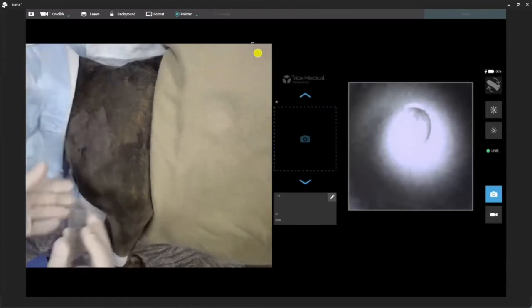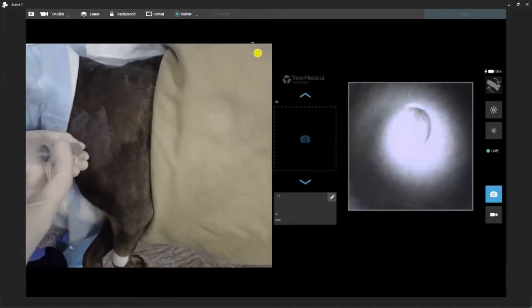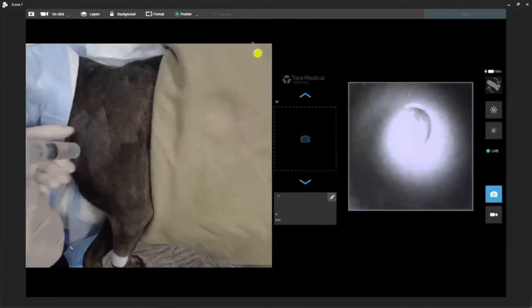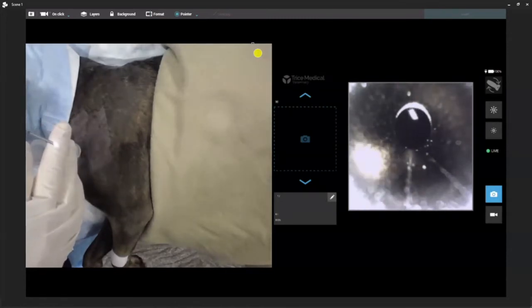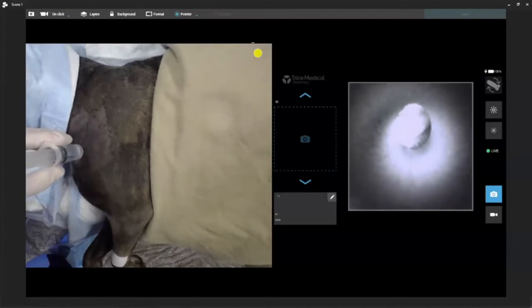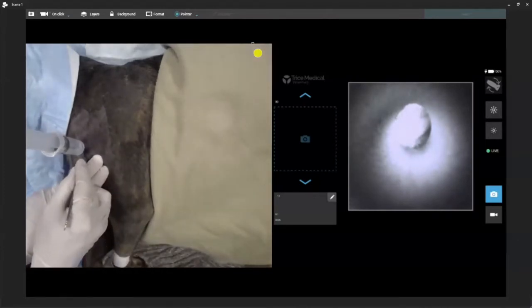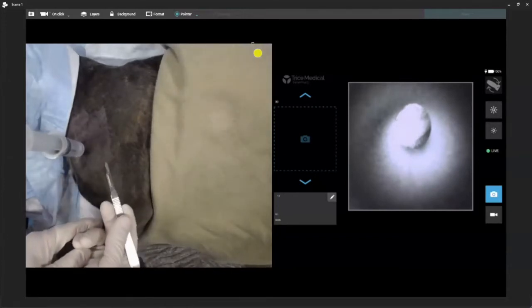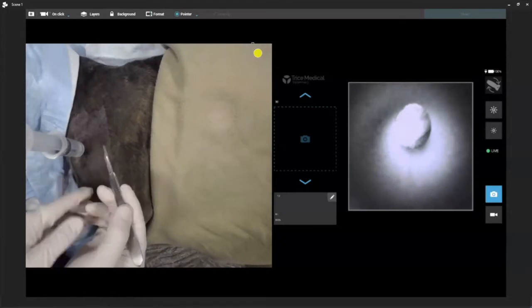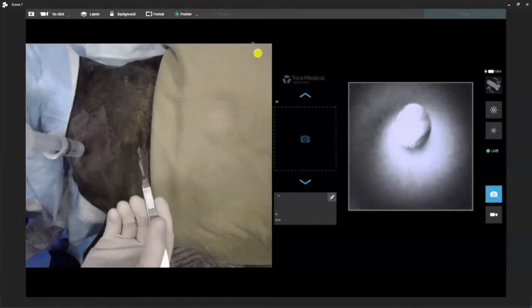I'm going to take a 20cc syringe. For a shoulder, I'll add about 5 to 10mL, just to distend the joint slightly. Even though there is a very sharp tip to the end of the needle scope, I try to preserve that. So I'm just going to take a 15 blade and make a little stab right through the skin alongside my needle. A lot of scope labs or training courses take the blade all the way down into the joint — I tend not to do that because I want to maintain my joint distension.